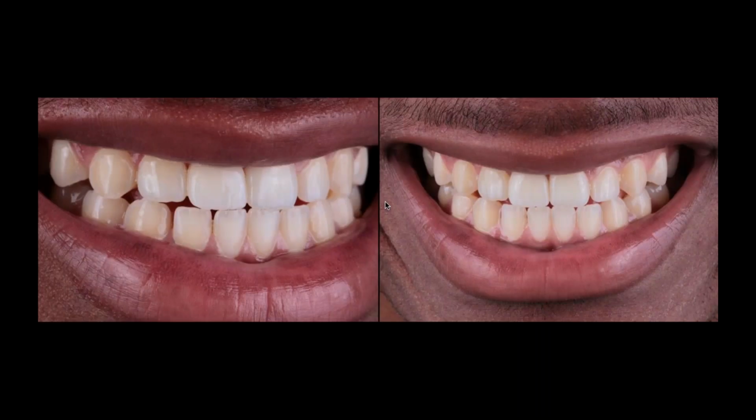So we see many patients that come for implants, but we understand that the growth of the maxillaries still goes on until the late 20s. So nowadays we like to delay the implant in younger patients. These are great tools, great options, for patients that might be going to college and don't want to use their retainer, the clip or whatever, but are still young for an implant. Then this type of resin-bonded fixed dental prosthesis, applying the APC concept, is of great help.